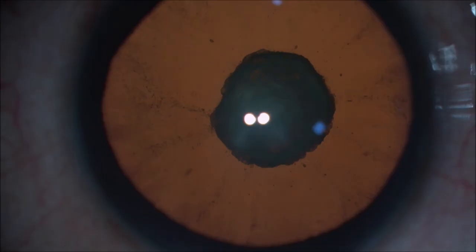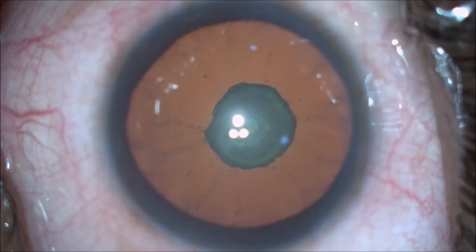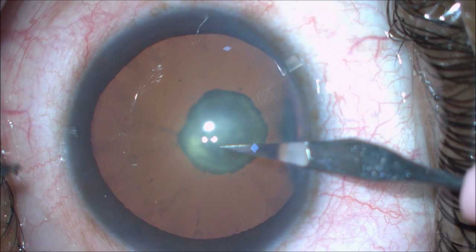Posterior polar cataracts have always been a challenge for surgeons. Posterior polar cataracts are the lens opacities that involve the subcapsular cortex and capsule of the posterior pole of the lens.